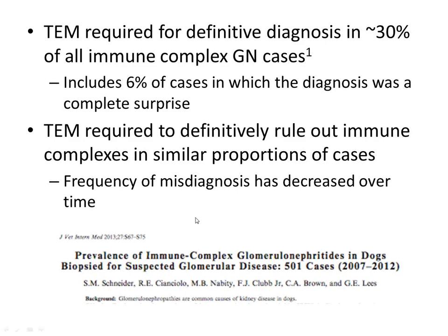I'm getting better at not misdiagnosing. I'm better at correctly diagnosing, I guess. I think that sometimes when I started 5 or 6 years ago, I would see a couple of little red dots on the glomerulus on the trichrome, and I'd be like, oh, it's membranous, and then we would go to EM, and it turned out it wasn't membranous.